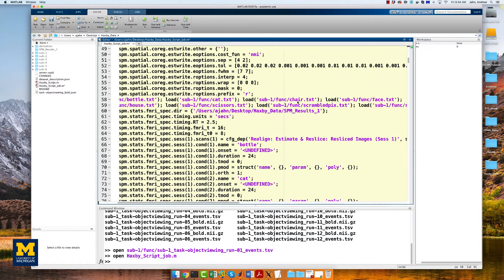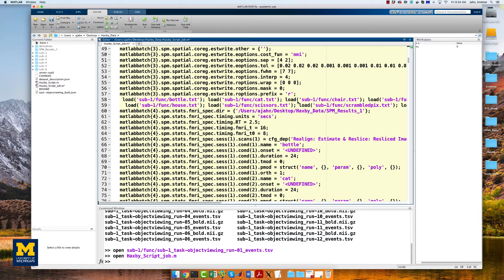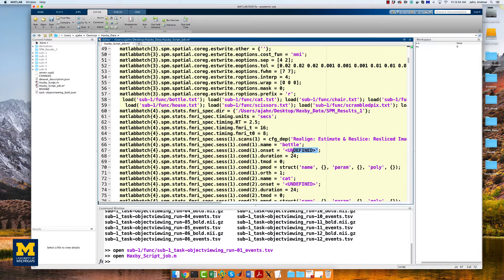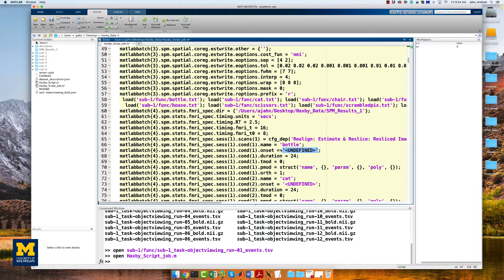Remember that when we created this script in the GUI, we left the onset times undefined. In the script, you will see the string undefined in all caps that was not filled in from the GUI. We will replace these with the appropriate values from the text files that we just loaded.